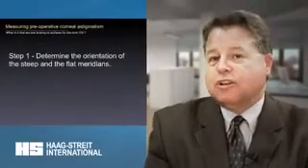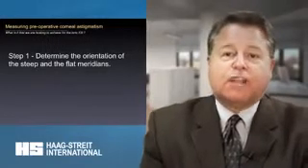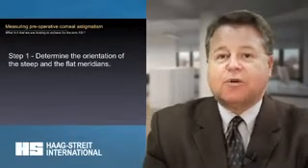But in order to get these low astigmats, we have to do the measurements correctly. So what is it that we're looking to do when we do preoperative measurements for the toric IOL? Well, forget about the fact that you're getting a set of Ks. That's not really what you're doing. This is completely different than determining the spherical power of a lens.